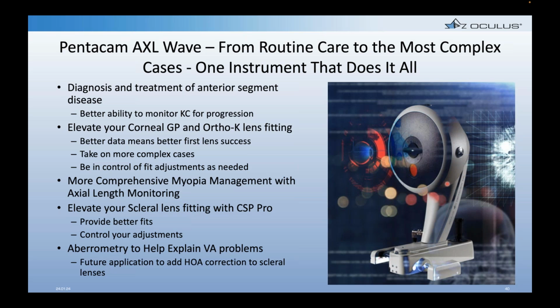And I just think that, again, often people will look at the cost of an instrument like this and say, that's expensive. And I say, but how can you put a price on the efficiency and the confidence that is instilled in your patients and in you as a practitioner, that this instrument can provide? So the impressive technical side, the efficiency, and again, just giving your patients good outcomes quickly and efficiently leaves a lasting impression.